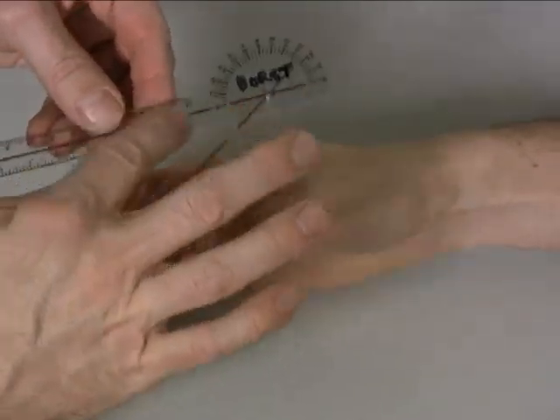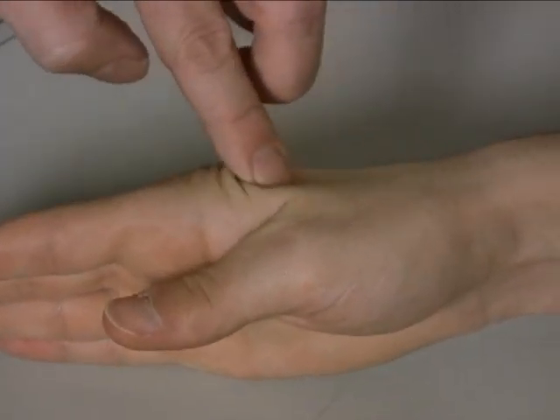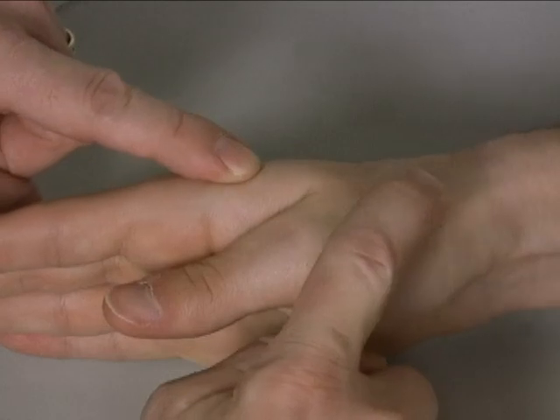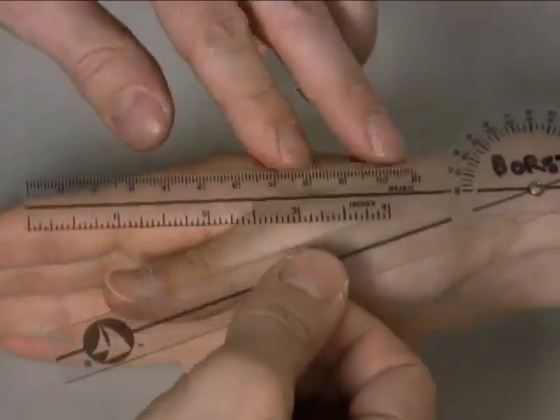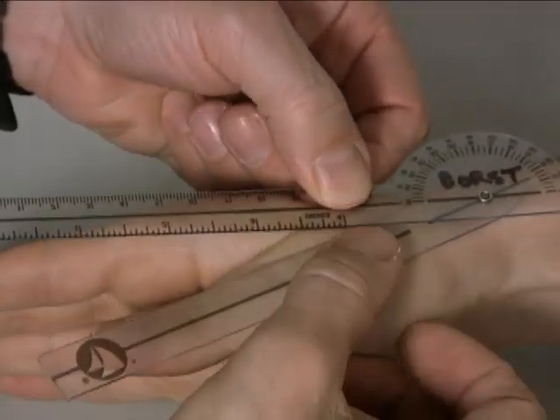The stationary arm is lined up with the index finger metacarpal, so I'll go ahead and palpate that. The moving arm is lined up with the thumb metacarpal. Once you have both of those palpated, simply line up those arms on those bones.